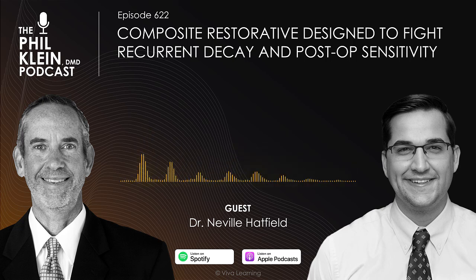And that, of course, was the big advantage of glass ionomer and continues to be, that it recharges the tooth and it's an ongoing process. The problem is it's not as durable and it wears down and needs to be replaced over time. But you're saying that now there's composites that have that same recharging capability, where there's an ion exchange that helps prevent recurrent decay and strengthen the tooth. Correct. There are.